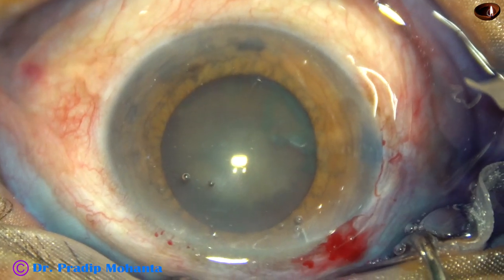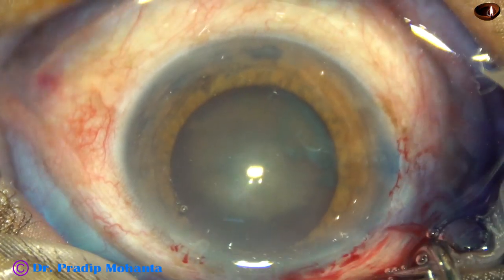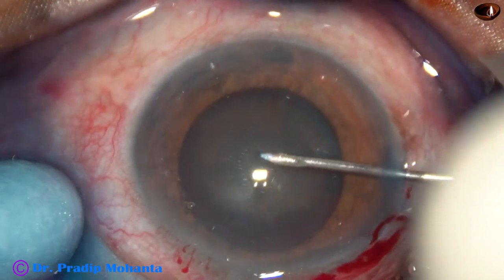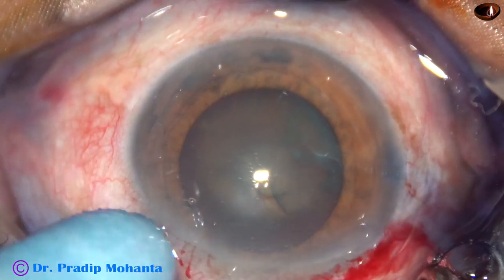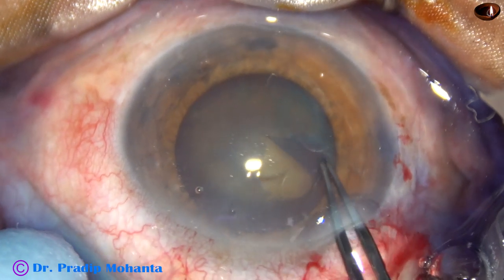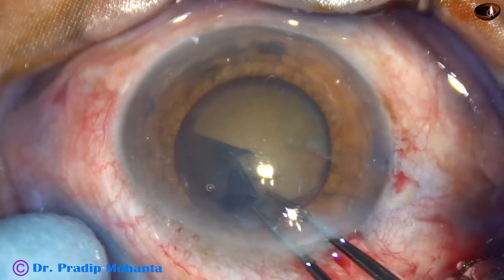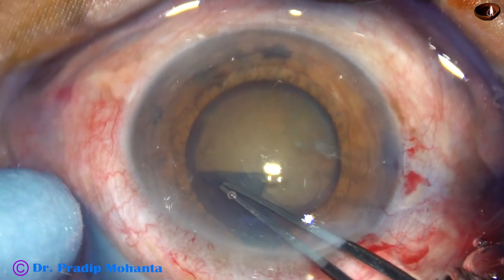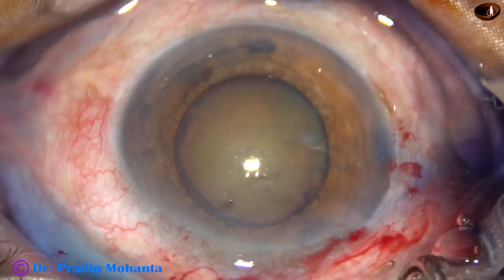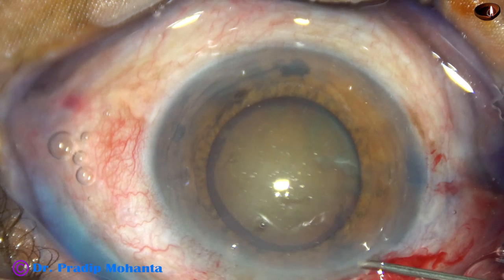Now capsulorhexis is to be done. Some more visco. A 26-gauge bent needle is used to raise a capsular tag. Then I hold this capsular tag with utrata forceps and go along the border of the pupil, because in this case the size of the pupil is around 5.5 mm. So I have got a rhexis of about 5 mm going near the margin of the dilated pupil.